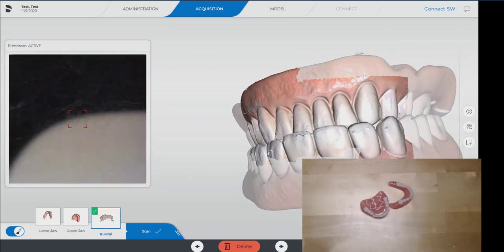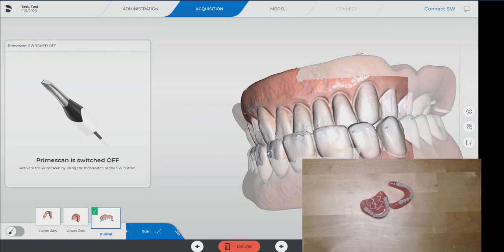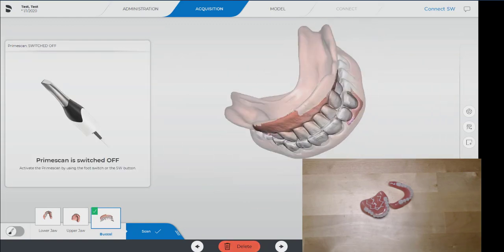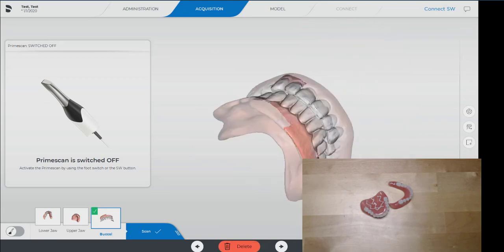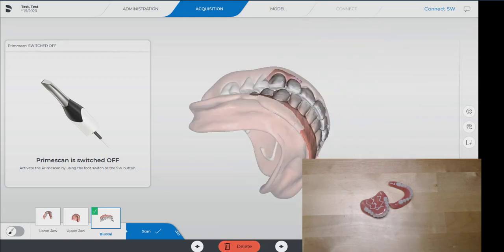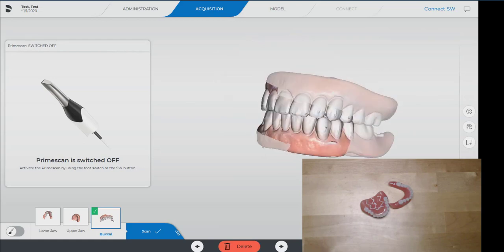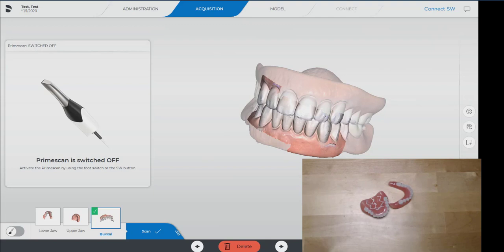Alright, so that is how we would scan an upper and lower denture in. And situations where we might use this: say a patient has a set of dentures and wants a new set of dentures. We might do a light wash impression inside the existing dentures, scan them in three dimensions, scan the bite, send that to the lab and let the lab go ahead and do a wax setup for us. There are several applications, but it's just an important skill to know that you can and know how to be able to scan dentures into the CEREC software. Thank you.